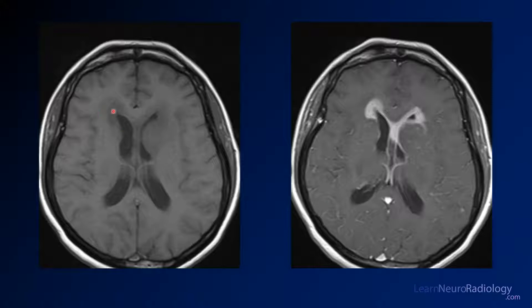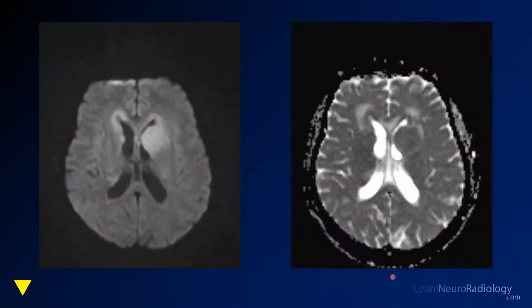Coming higher, you'll see confluent enhancement around the margin of the ventricles. Interestingly, the mass in the left basal ganglia is not enhancing very much, but most of this tumor is enhancing very avidly. On diffusion, those areas are very bright on DWI and somewhat dark on ADC, suggesting very tightly packed cellular material.